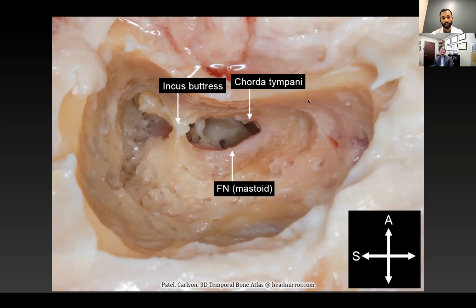The other thing that I'll stress is there's a change in angle that happens halfway through the cochlear implant operation. Initially, when you're thinning the ear canal, often you have the patient's head rotated pretty far away from you, or the scope very far down, looking anteriorly, so that you can visualize the ear canal really well and thin it really well. It also allows you to see into the antrum a little further if you have some bony overhang over the incus or whatnot.